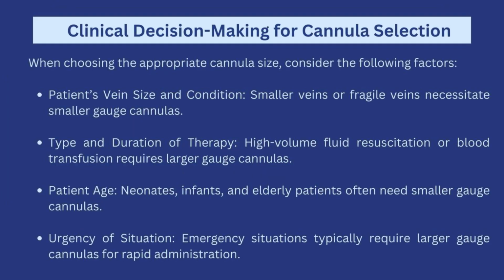Seeing that there are different forms or types of IV cannulas, here are some things that are considered before choosing which cannula size for what patient. Number one is the vein size of the patient and the condition of the patient.